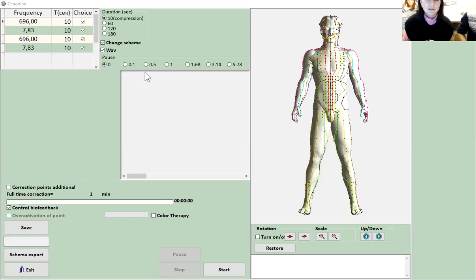So if I've got one of the Monicors that doesn't have that thing you just showed with the white coil, it means I have the latest model. And so I just put it in the little indentation spot. Yeah, you just put it here, and it's closed here, because sometimes there was an even more advanced device, so you have other stuff. So it's either this one with this external, or it's already in there. Okay, so I just lay a little piece of magnetic tape there.